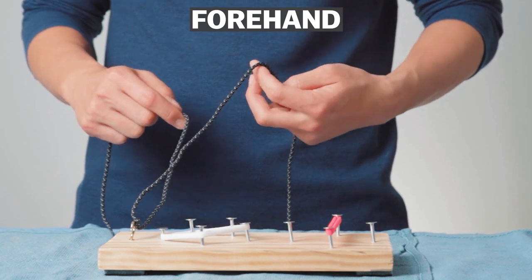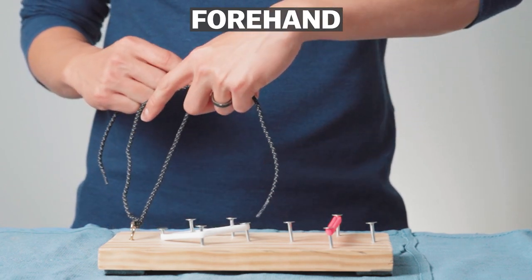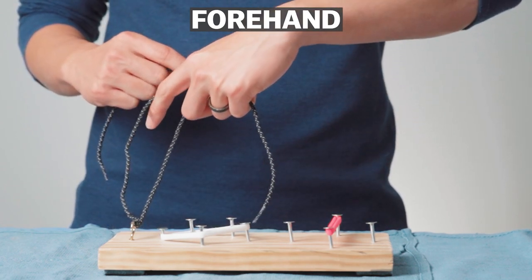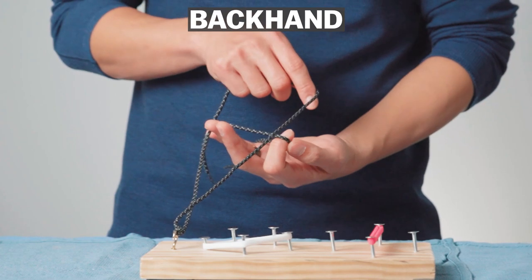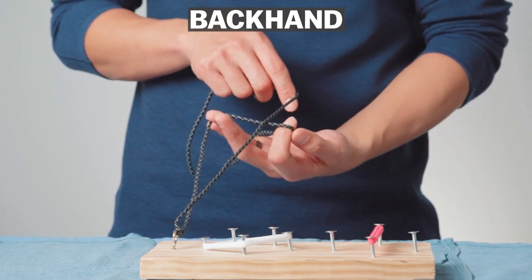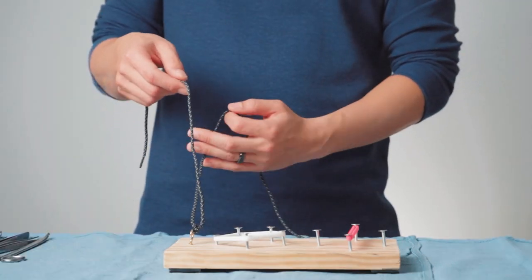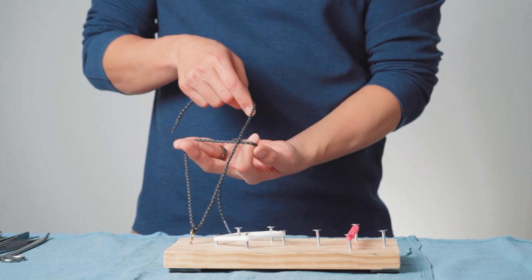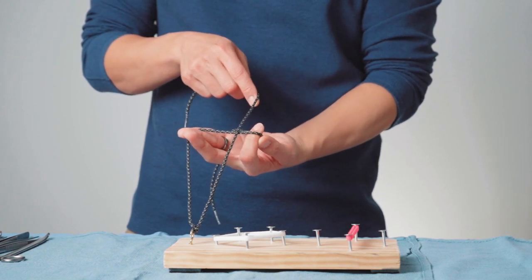If you're coming from the top with your index finger, that's called the forehand. If you're coming from the bottom with your middle and ring finger, that's called a backhand. In this instance, we've created a loop from a backhand approach.